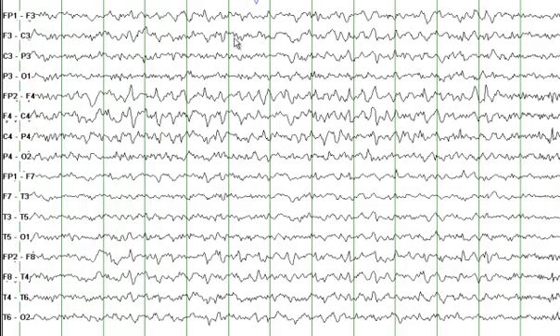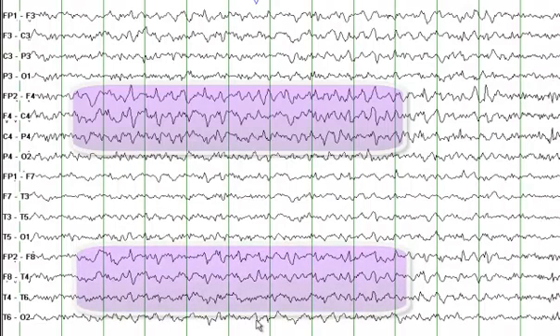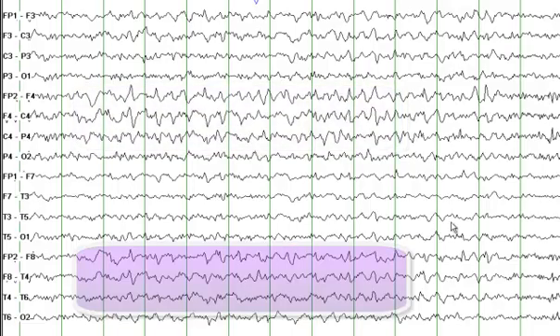Sharp waves are seen almost on every other page. Although the EEG shows slowing in both hemispheres, the amplitude on the right hemisphere, here and in this region, is higher than when compared to the left hemisphere.